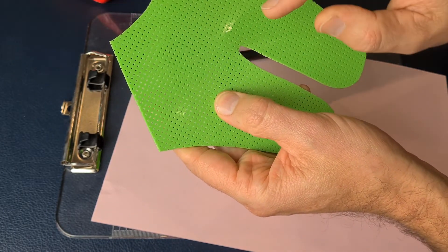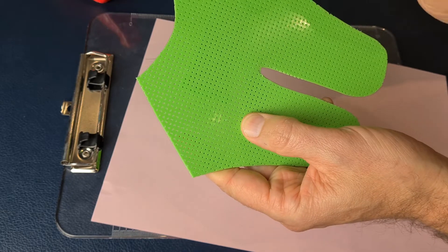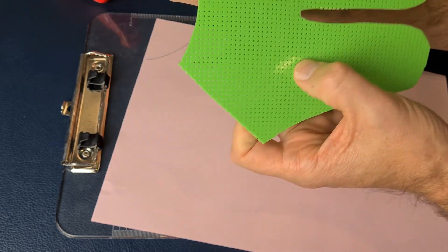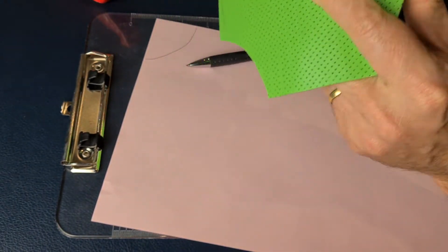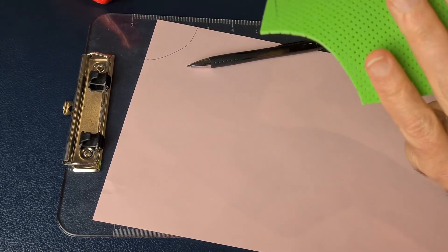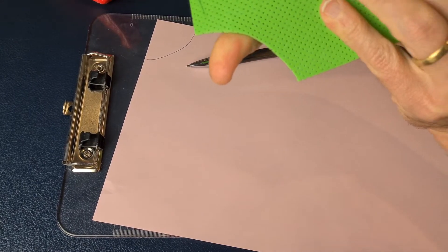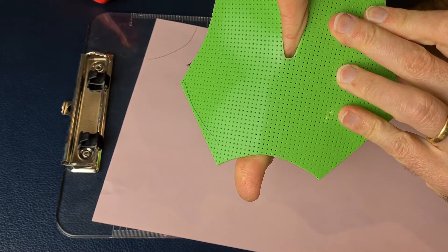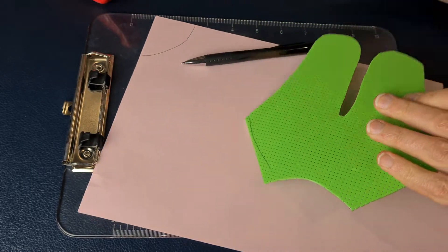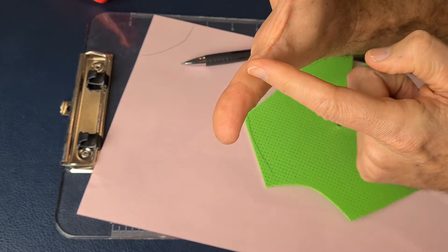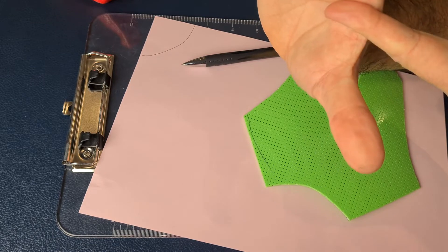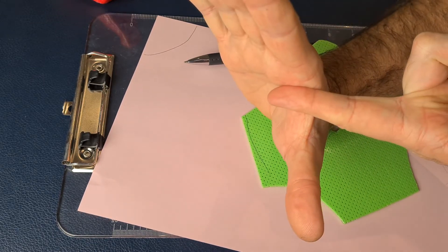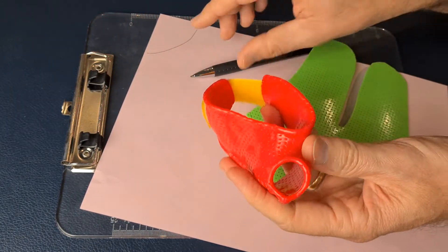That measurement is going to be from the IP joint through the web space of the thumb. So it actually goes from the IP joint crease to the distal palmar crease at the base of the index finger.